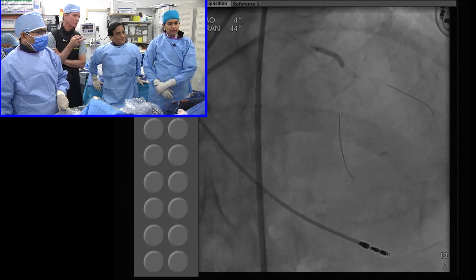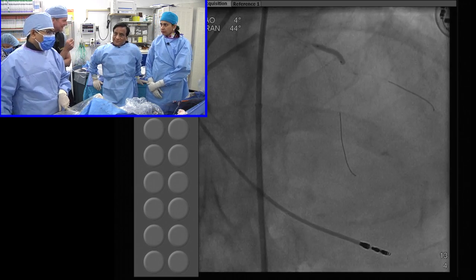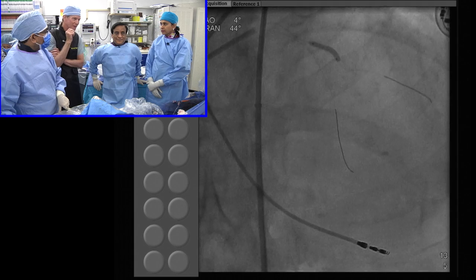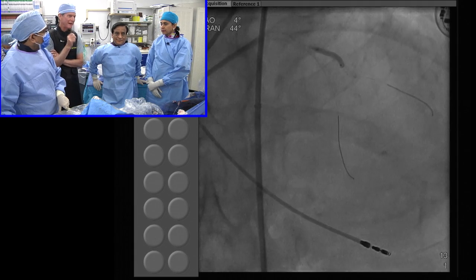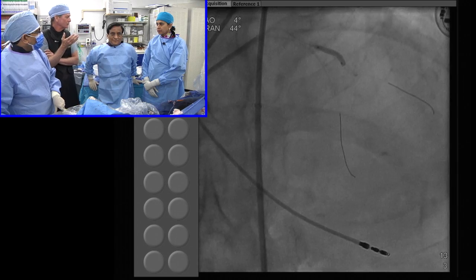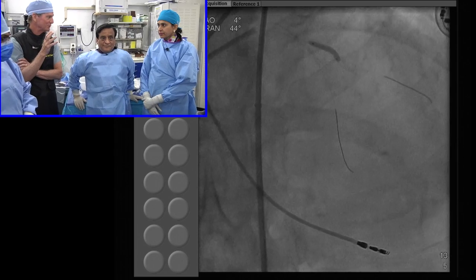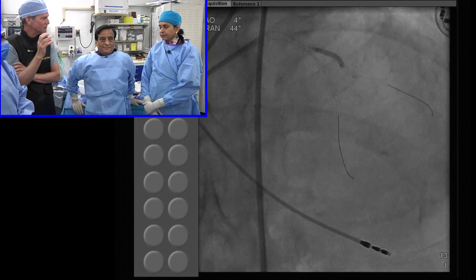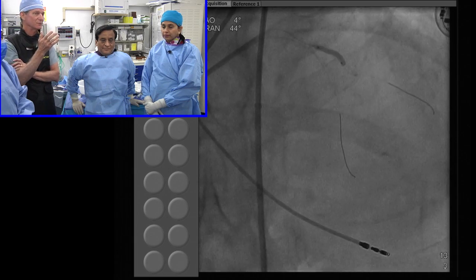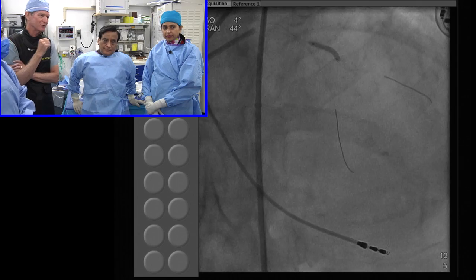And then just 2 quick points on the LAD for Absorb. When we first looked at this film, we said, look at the calcification, right? But this shows you in the hands of operators that know how to do plaque modification with Rotablator. You could perhaps have used even a scoring balloon or cutting balloon, but I think rotational atherectomy here was a great choice. The prep you got after you did that and then the NC balloon made a tremendous lumen for the delivery of Absorb. And I don't know if people were watching, but the Absorb went straight down without any resistance at all. Right. So that's what makes for a great procedure.